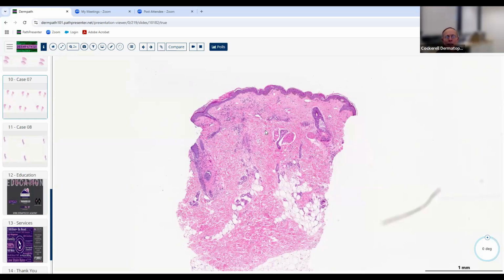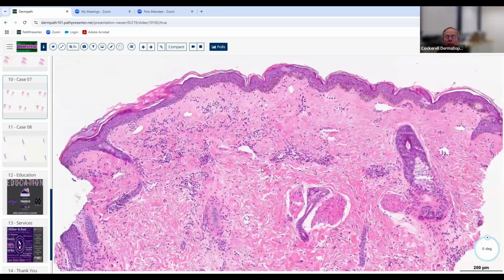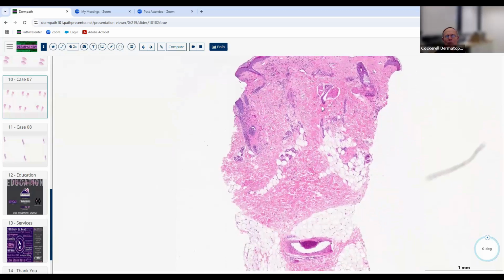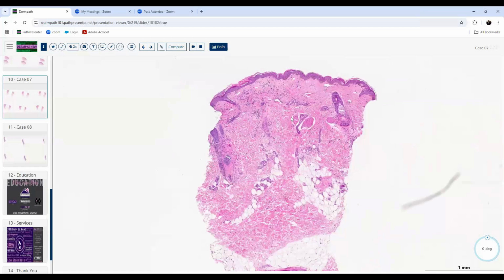That's what you see when you biopsy that. But this is what you see in the early inflammatory stage of morphea, and it's one of the differential diagnoses of the interstitial mostly pattern. So interstitial mostly, with EOs, plasma cells, lymphocytes, and thickened septa, think of the early inflammatory stage of morphea like we see here. Probably a little tough to show you on a board examination without some information, but at least know what the pattern is here, and you'll be able to get it the next time you see it.